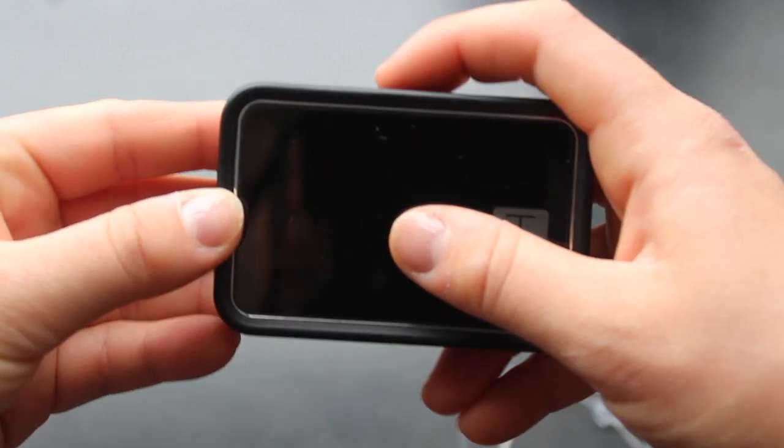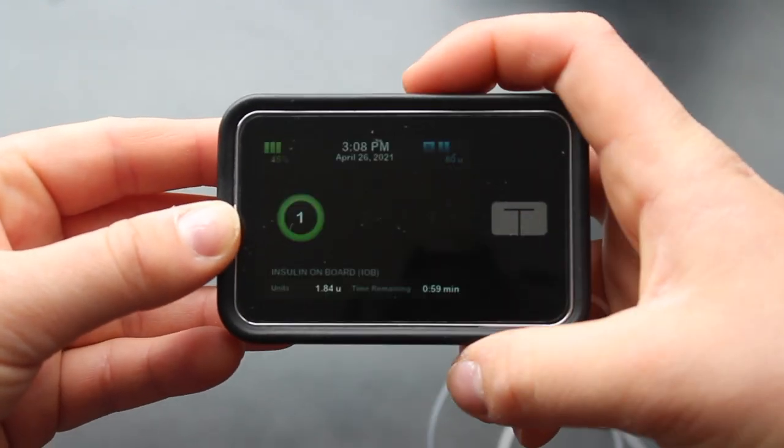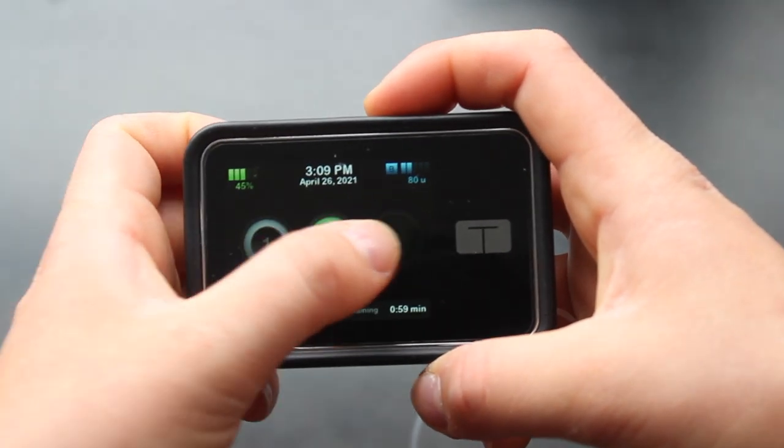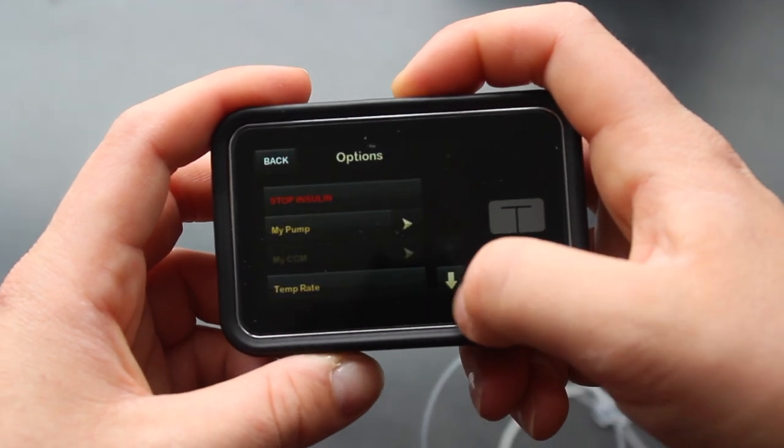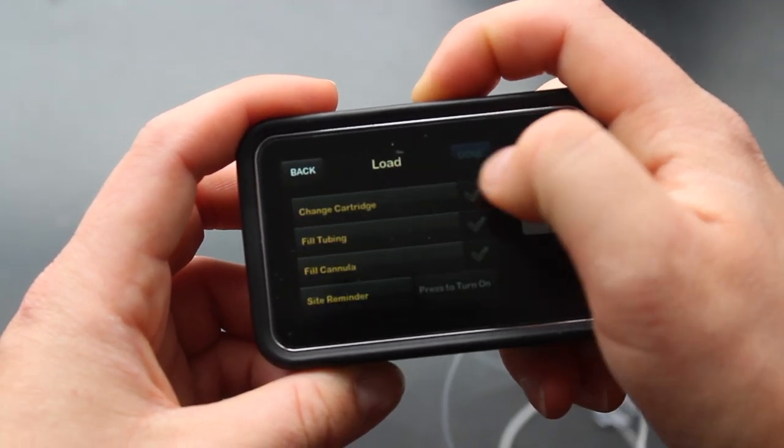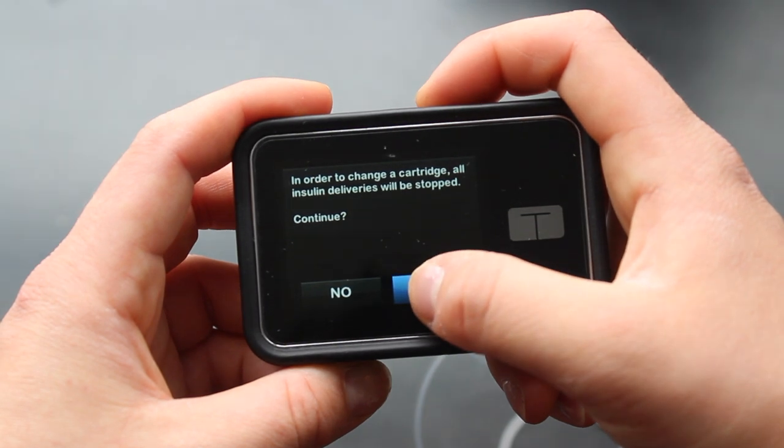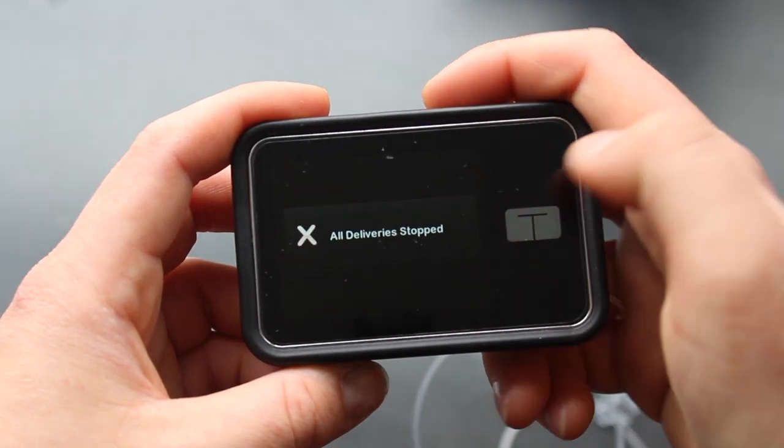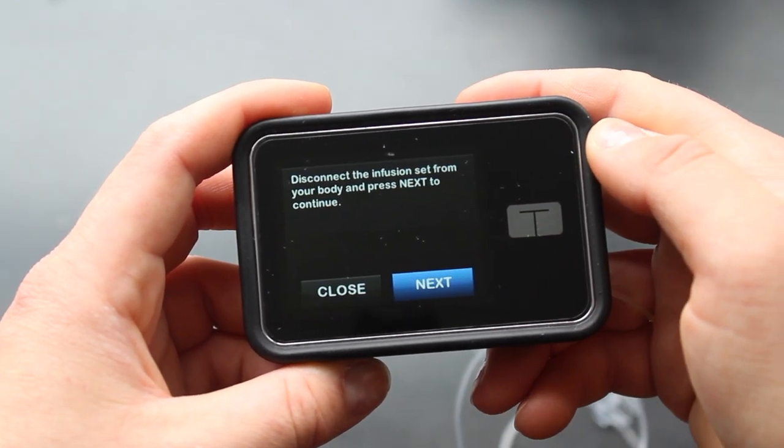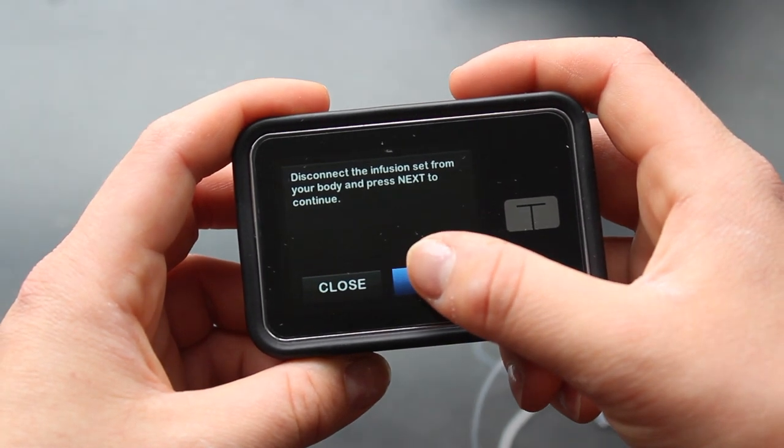The next thing I'm going to do is unlock my insulin pump using this button on the top, and then use the screen feature to unlock it. I'm going to go to options and down to that second page where it says load and change cartridge, and this will allow me to stop the deliveries so that my pump isn't trying to work while I'm changing the insulin.